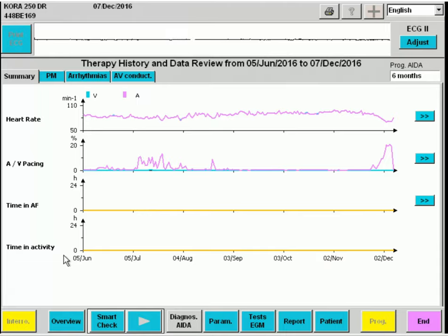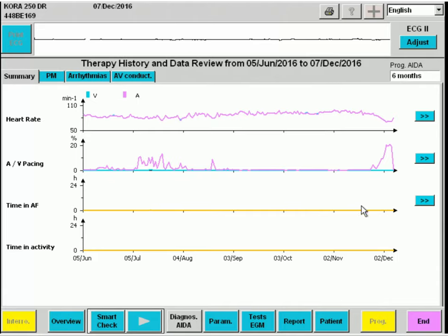We observe that the heart rate is relatively stable. We do see variations in atrial pacing percentage between 0 and 20%. We don't see detection of atrial arrhythmias, and the patient activity is not shown in this case.